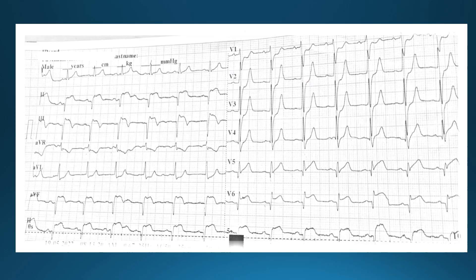This is a 43-year-old female who presented with complaints of apprehension for the past four hours. Looking at the ECG, what we need to see is: is it a sinus rhythm, is there any issue with the ST segments, the QRS complexes, and other intervals? Looking at this ECG, we can see some changes going on. The changes are present in a few leads, including the inferior leads — lead 2, lead 3, and lead AVF — and also in lead AVR and the anterior chest leads.